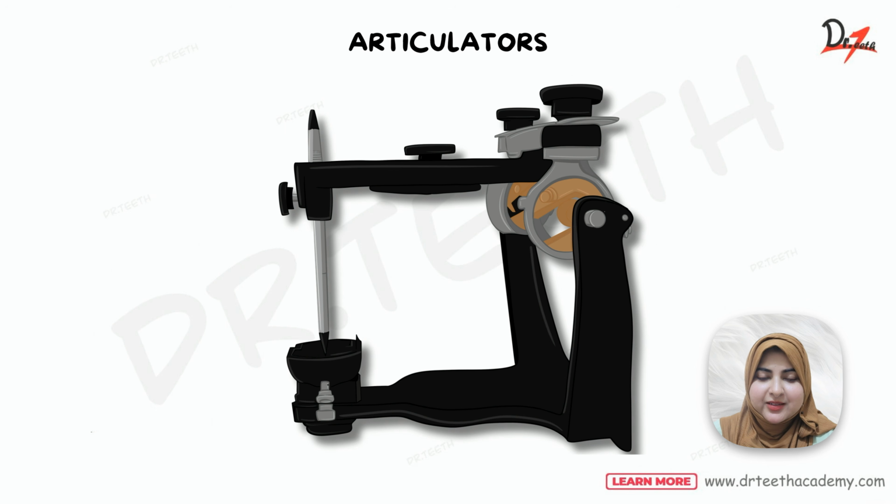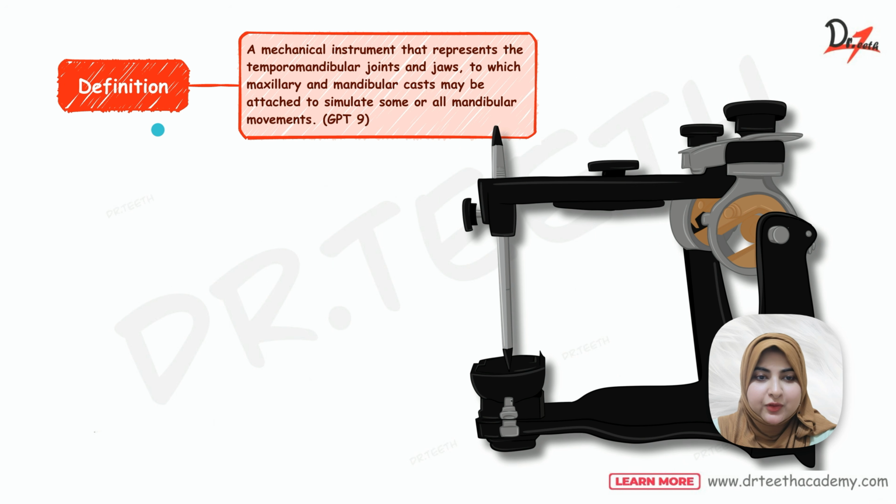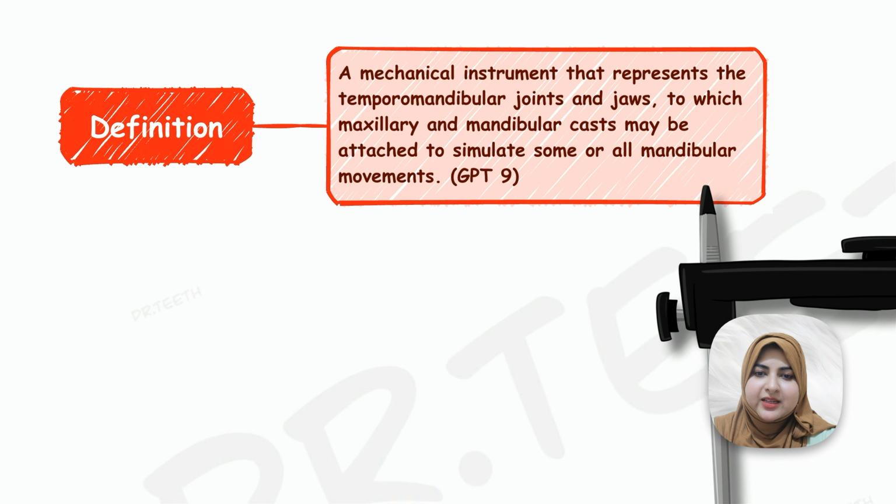Articulators are very important to understand no matter at what stage you are, okay? So we will go through all the types of articulators in this video. And first, we will start with the definition of articulator. So, what is an articulator?